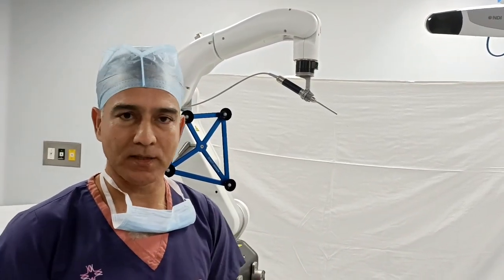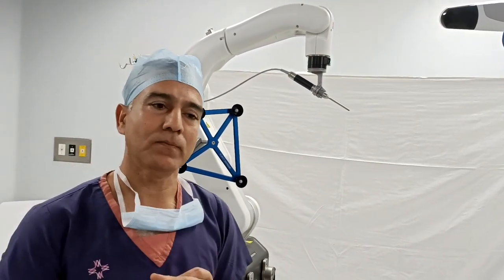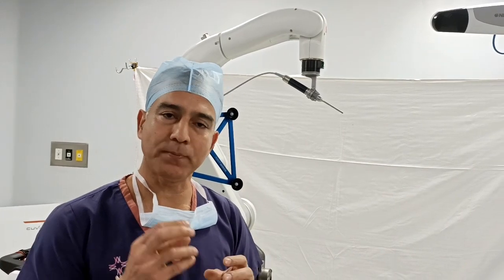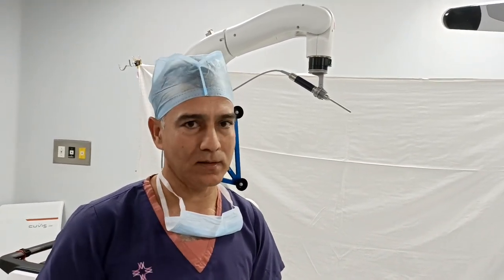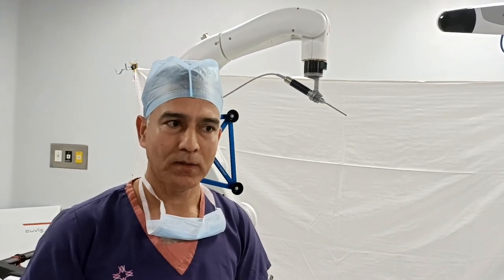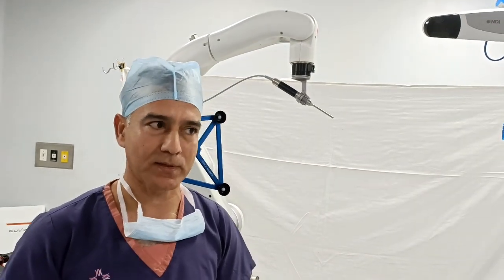That is the surgical expertise. But the implant positioning, bone cuts, and the precision we need — sometimes it is called human error, and it is always a factor. That is the reason why the patient's life of the implant and its performance can be different.